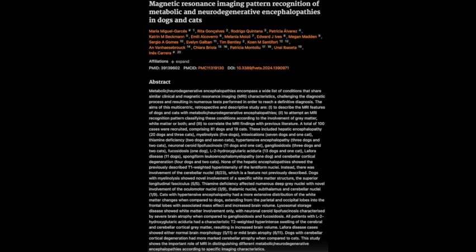Definitely. Okay, so then what about gangliosidosis and fucosidosis? Those two conditions showed similar MRI findings. Okay. They both had increased signal intensity in the white matter. Okay, so that's kind of like a common theme we're seeing here. Yeah, it is. White matter involvement. But this time, it's not because of a toxin or myelinolysis. It's because of this genetic metabolic disorder.